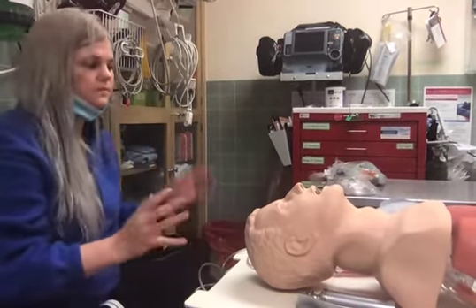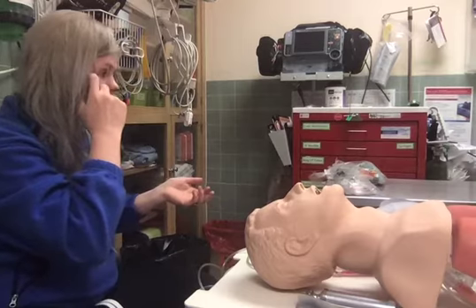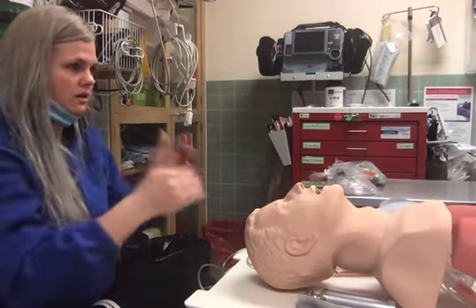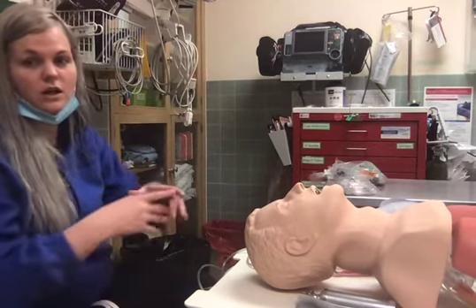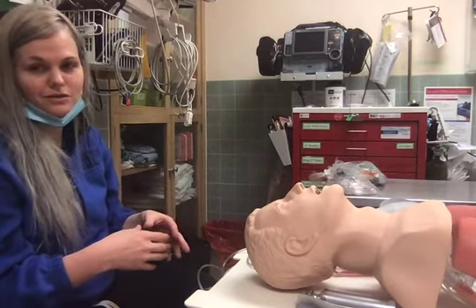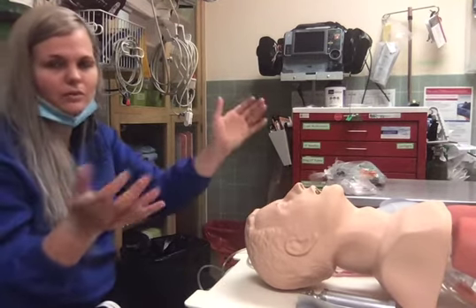So, as we've talked about some of the different things that you may utilize during your oxygenation ladder, now it's time to talk about the actual ladder itself. So oxygen therapy in itself: every patient that you run across uses oxygen therapy, if you think about it that way. Me, I'm on room air, but I'm still utilizing 21% oxygen.